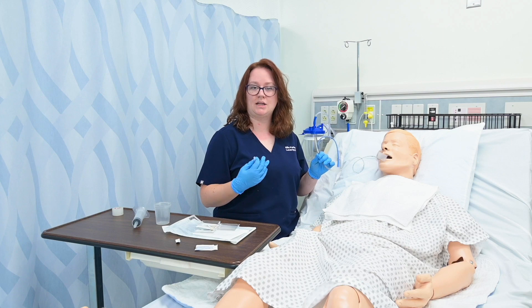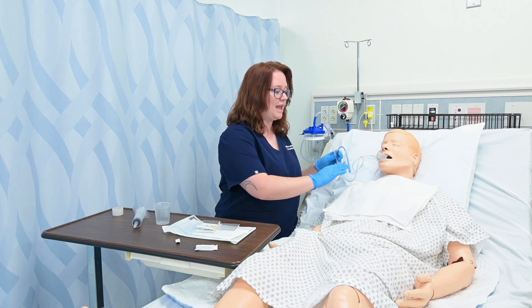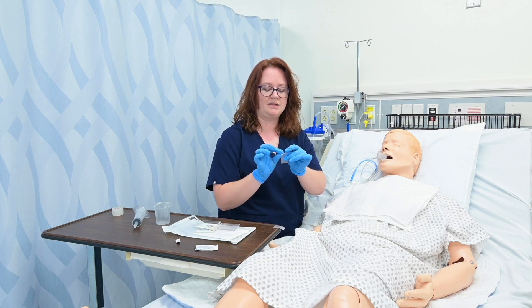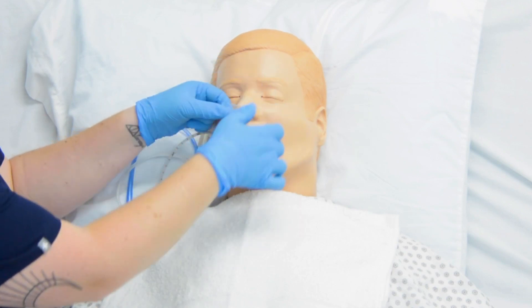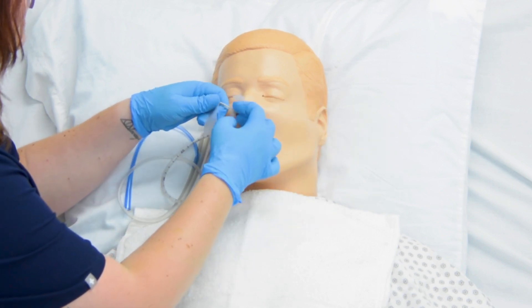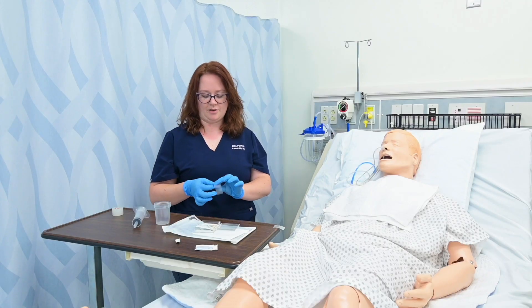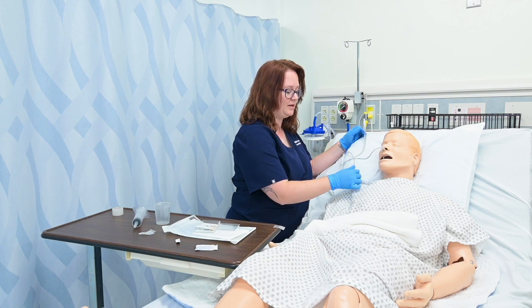After I check the pH and I'm fairly comfortable, and especially after the x-ray confirms correct placement, I can anchor this more securely and attach it to suction. Anchoring it more securely means anchoring it to their nose. There are devices that allow you to do this, but everywhere has tape. So I can split the tape halfway down, put the solid portion on their nose, and wrap the remaining portion around the tube. This is called the split tape method.